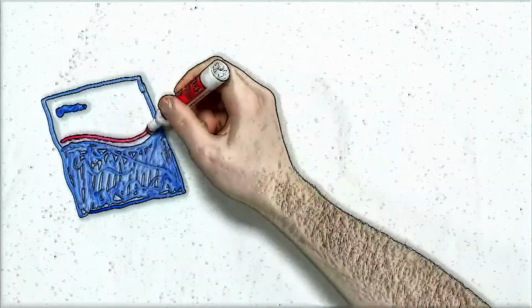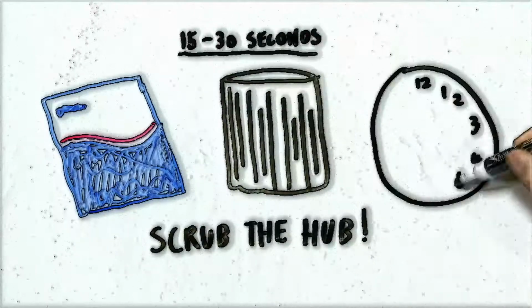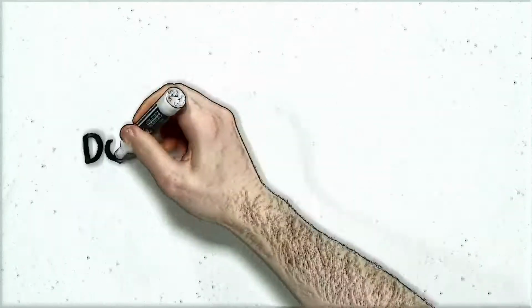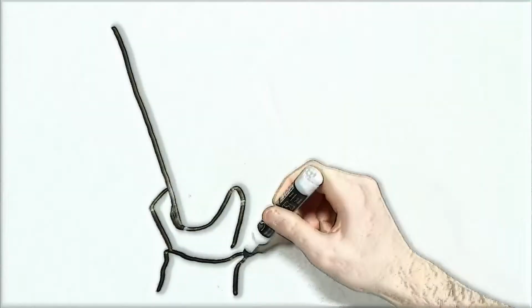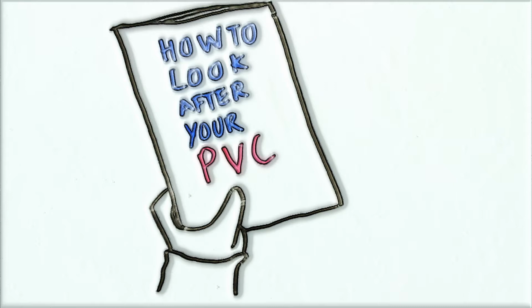When the PVC is in use, the hub should be scrubbed for 15 to 30 seconds using a chlorhexidine and isopropyl alcohol wipe and allowed to dry. The PVC should not be disconnected during administration of intravenous therapies. Patients should be provided with an information leaflet.